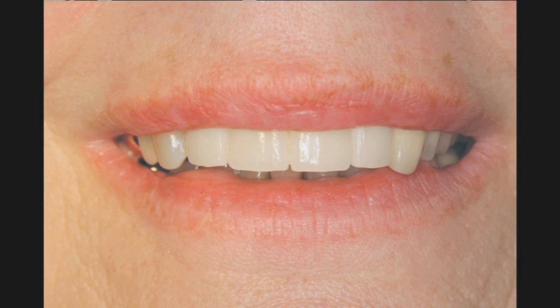Immediately following implant placement, we put in temporary abutments, and we loaded a transitional bridge. However, if you did not feel comfortable with that, we could have taken a step back, put the custom milled healing abutments in, and relined her flipper and let her wear that in a more conventional method.